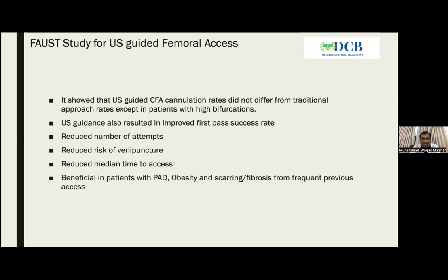To be very practical, most of the time when we started we were not able to appreciate the exact common femoral artery where to hit. You need to have some experience with it, but truly, if you have to look for the machine, where is the machine? Let me go and seek it. Let me find where is the probe. In this case, it's a waste of time.